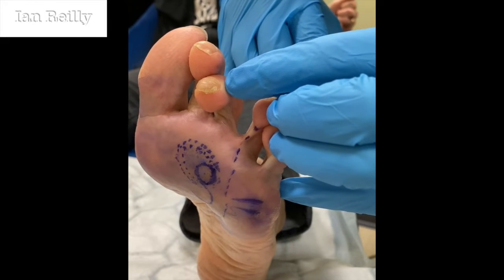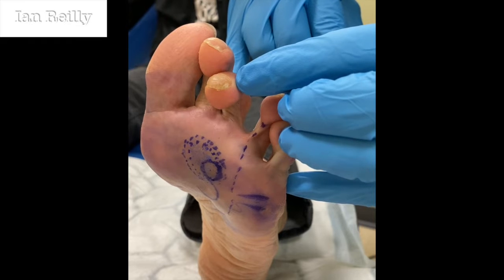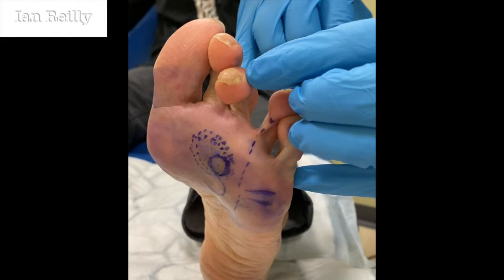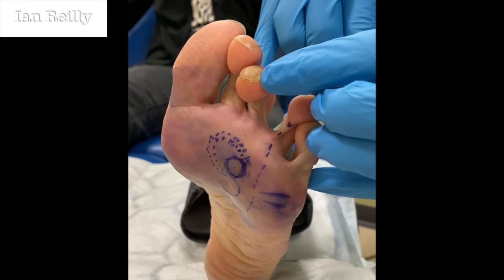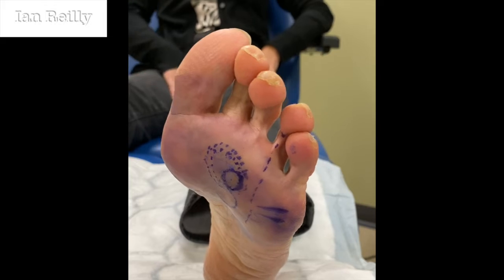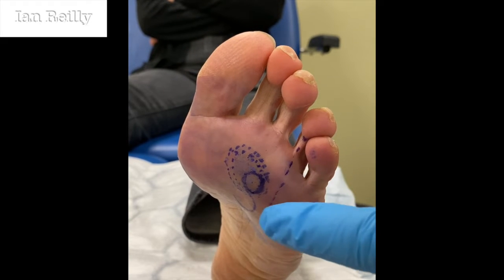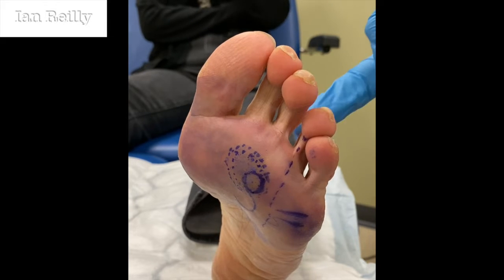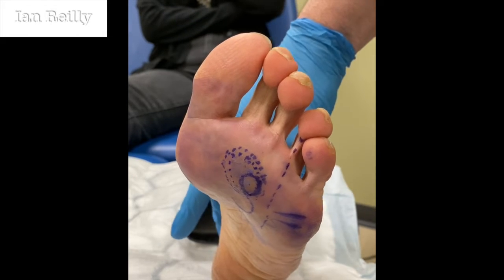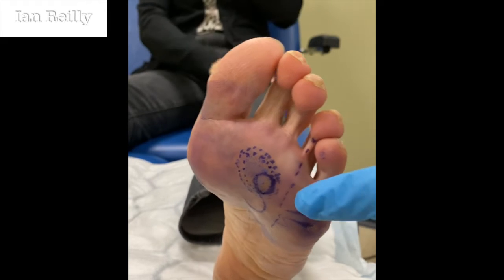You might feel a little slight jagging as I get close to the area — just a little pinprick coming through. One of the things we teach in anaesthetics is we don't like to do an injection through the bottom of the foot because that really stings. So I do a little cheat technique where I come from the top — that first scratch you don't feel badly because it's fine skin. The other option is to go for the ankle nerve, but that takes a while to go off and you're quite close to the big nerves which can be scratchy. This approach is kind of nice in terms of efficiency.